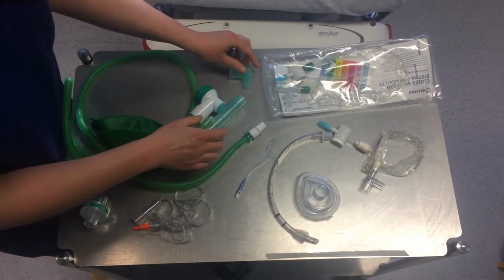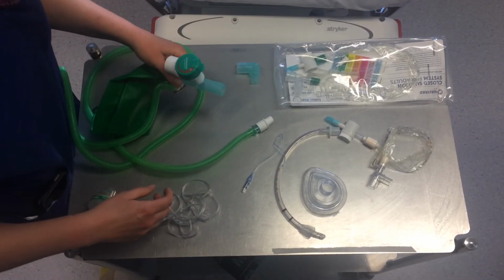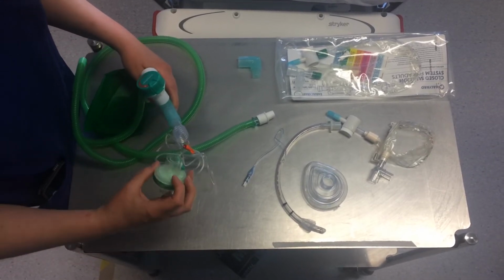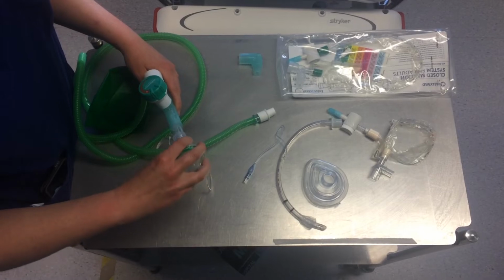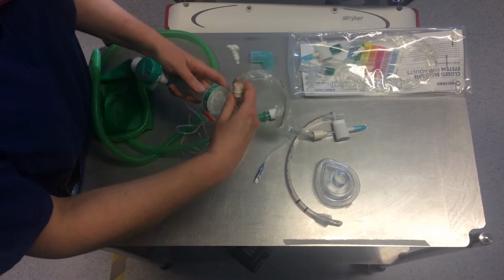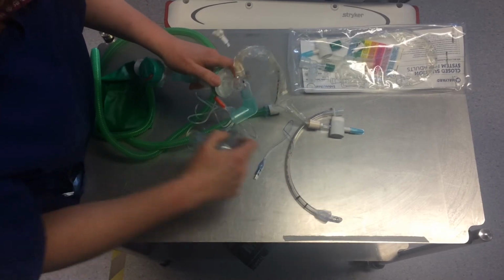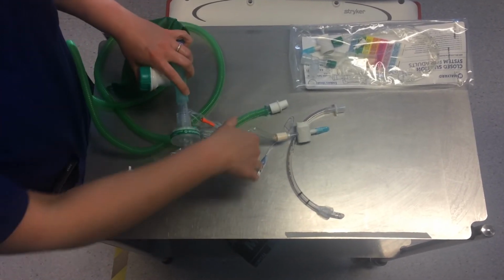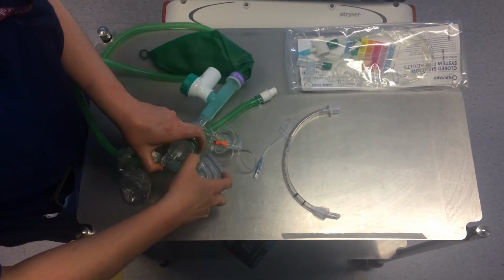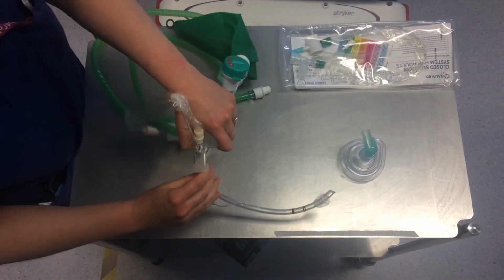But for smaller inline suction, you would connect, as before, your end-tidal CO2 to the circuit, and then your filter, your suction, the angle piece, and then the mask. And again, you'd use this for pre-oxygenation, and once you've intubated, you would remove the mask and the green angle piece, and then pop this directly onto your endotracheal tube.